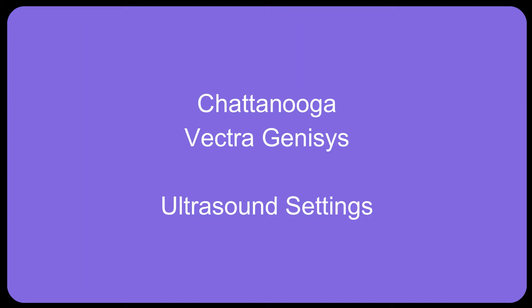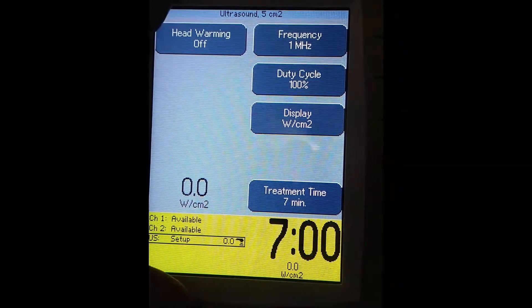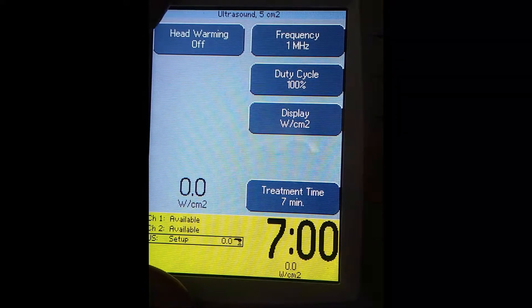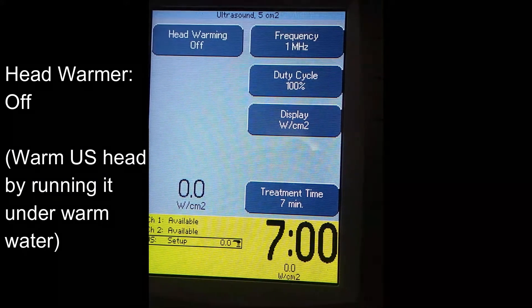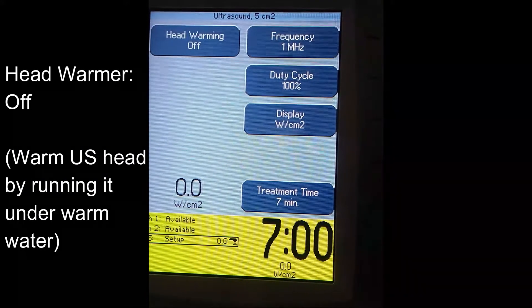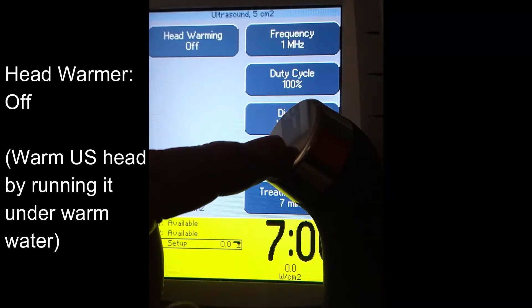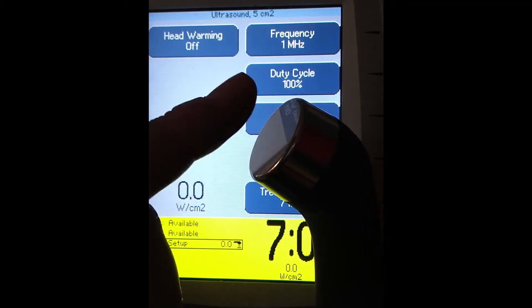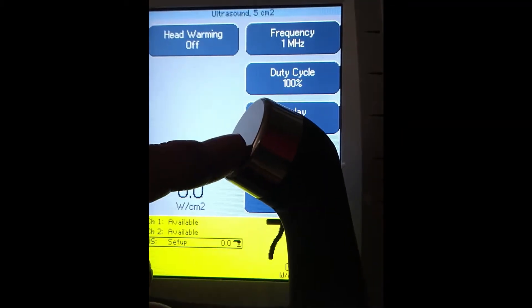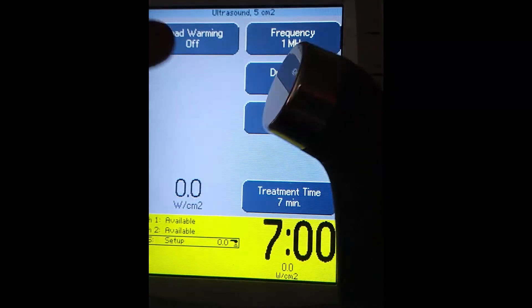Chattanooga Vectrogenesis ultrasound settings. This is the ultrasound screen on the Vectrogenesis. Keep your head warmer off because you don't want to injure your applicator head. The head warmer turns it on to about 0.5 watts per centimeter squared and gets warm, which will degrade the crystal of the ultrasound head faster. This is an expensive item to have to replace.